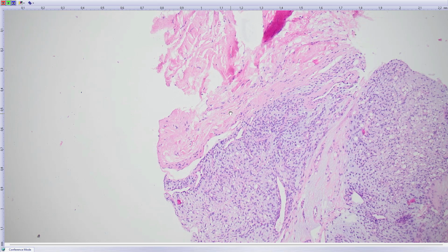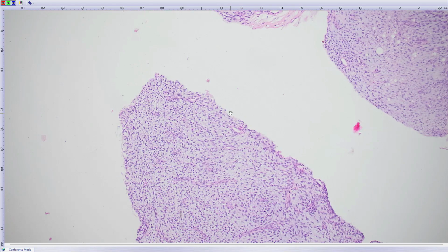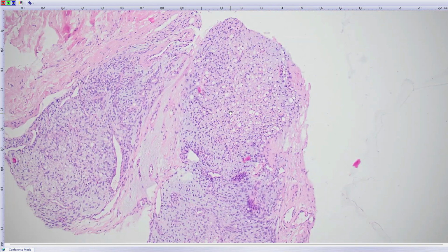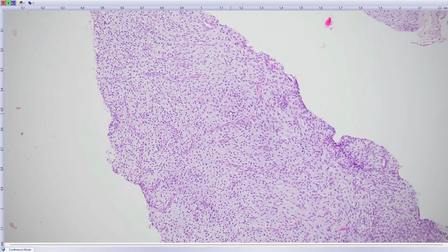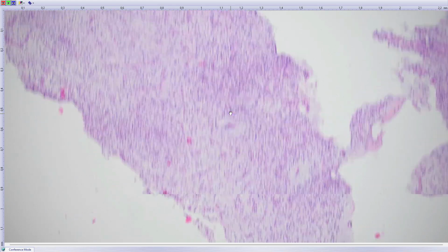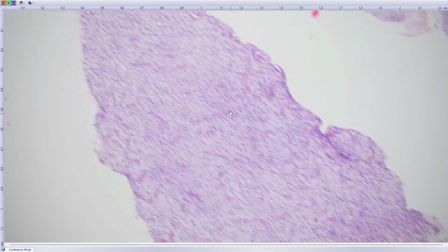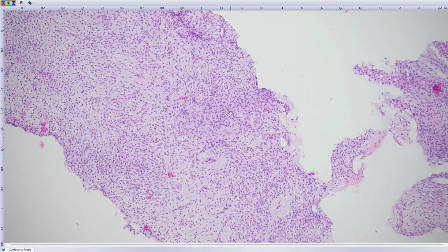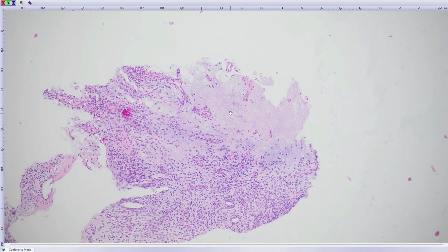So a relatively young patient, lower extremity thigh with this morphology, so some lipomatous differentiation, this prominent arborizing thin-walled vasculature, monotonous proliferation of ovoid cells. This together gives number one differential diagnosis. Anybody has a suggestion what this could be? Excellent, yeah. This is very suspicious for, or almost histologically diagnostic for myxoid liposarcoma.